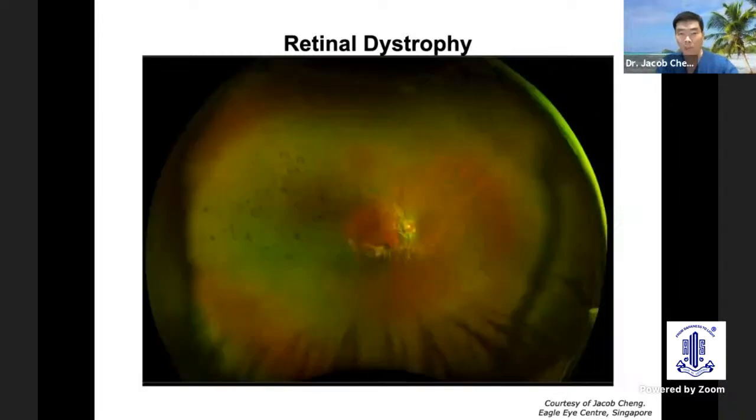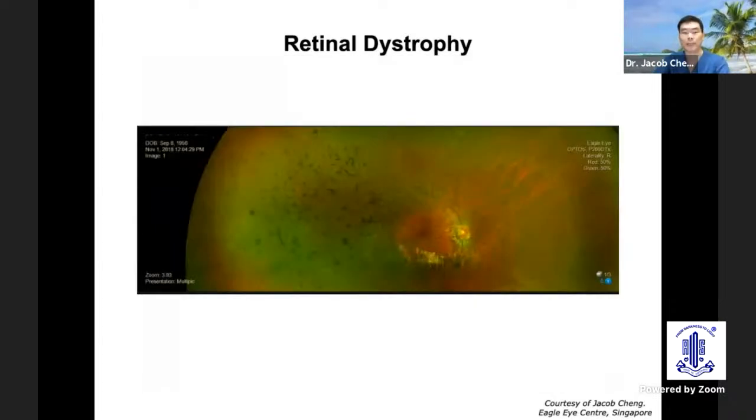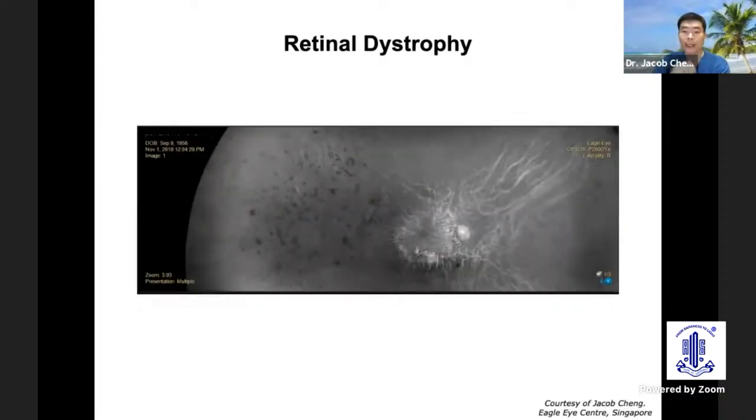And again, on the opposite eye, not as much choroidal atrophy, not as much bony spicule pigmentation as the earlier patient, but because of the choroidal pathology and atrophy, this patient actually presents with worse vision compared to the earlier patient. So here, a close-up view with the color fundus photograph, as well as the green channels and the red channels, looking at the attenuation and thinning of the choroidal vessels.